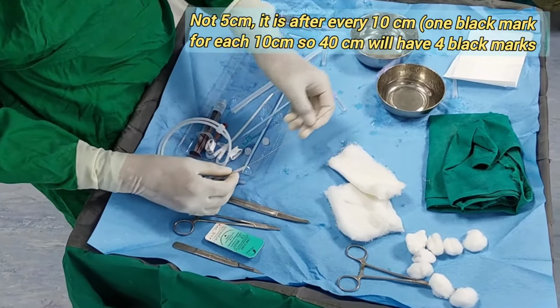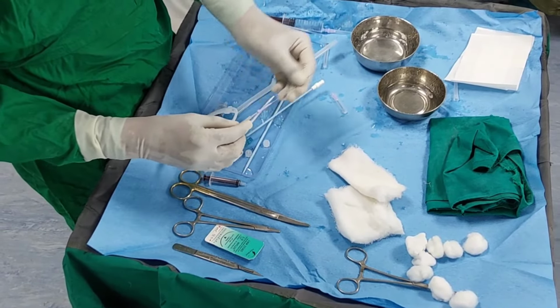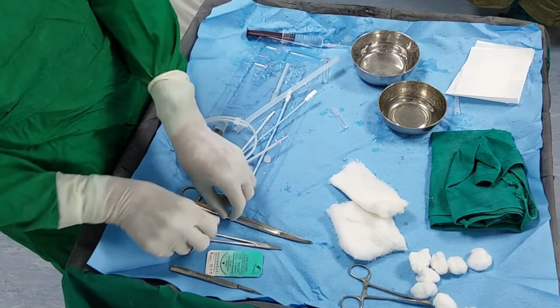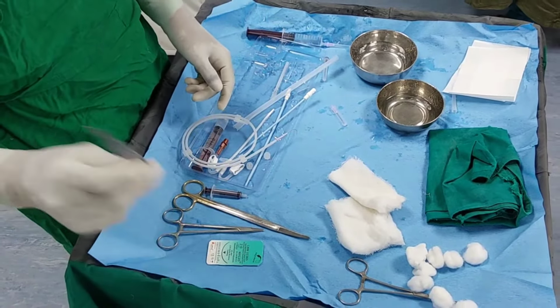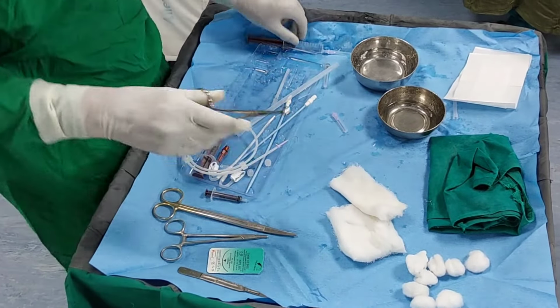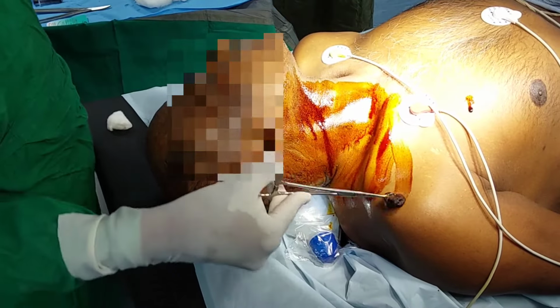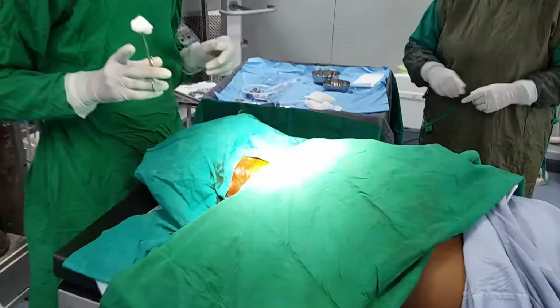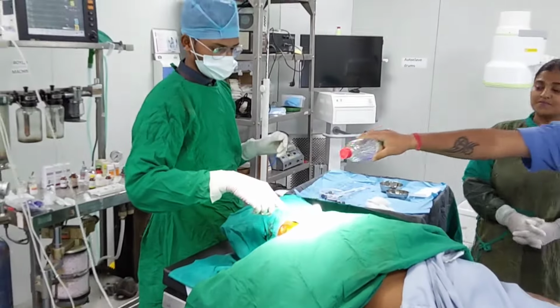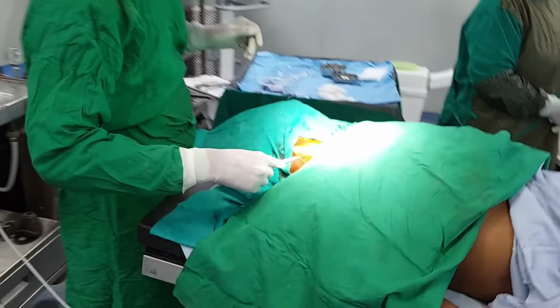Along with this you will need the suture material, a scalpel with number 11 blade, a needle holder, scissors and a sponge holder. Also you will need two 5 ml syringes and one 2 ml syringe. After giving the proper position, clean the area with antiseptic solution and cover it with sterile linen, and before that you can use a skin marker to mark the site of puncture.